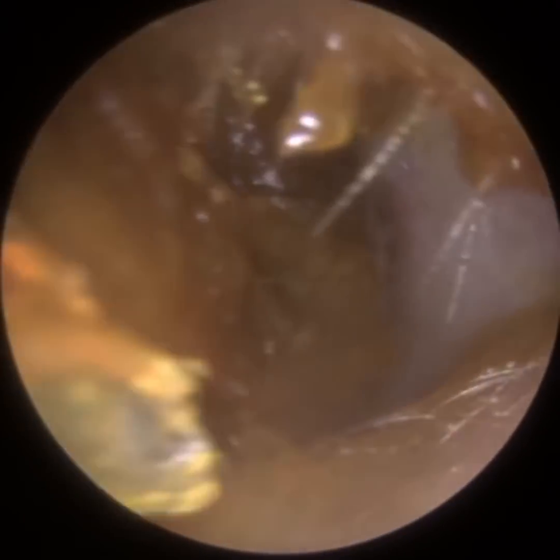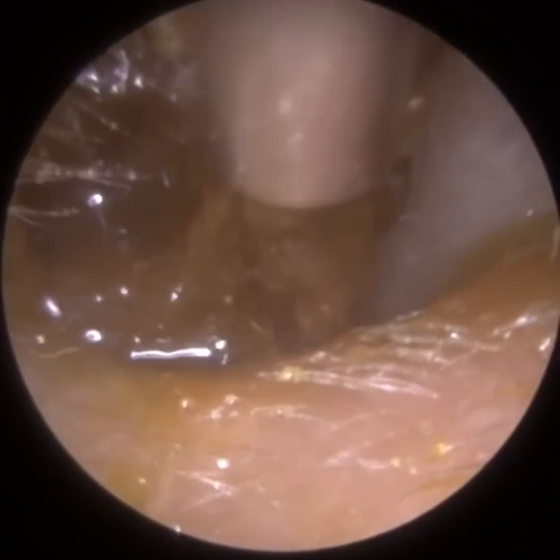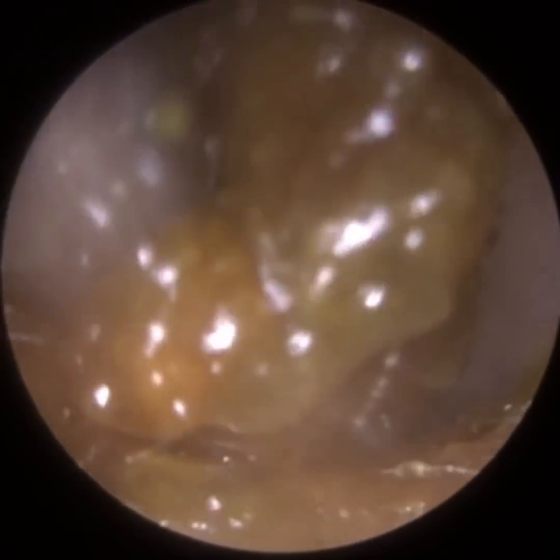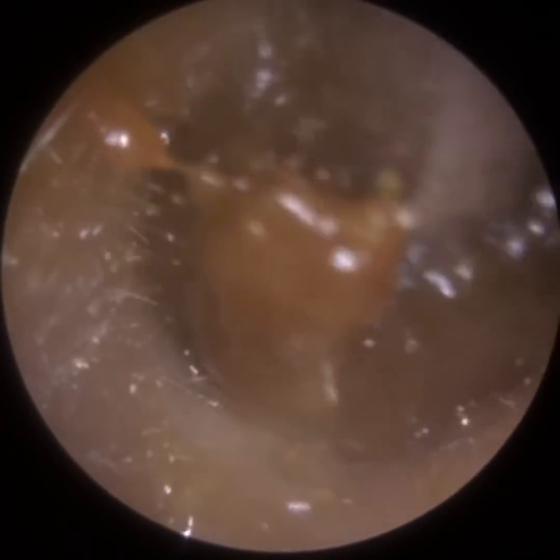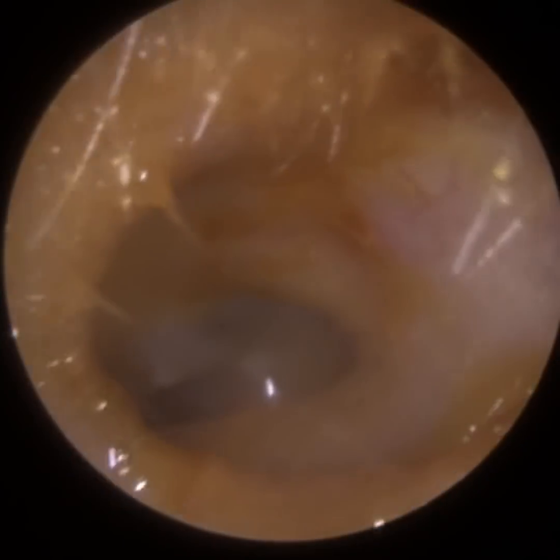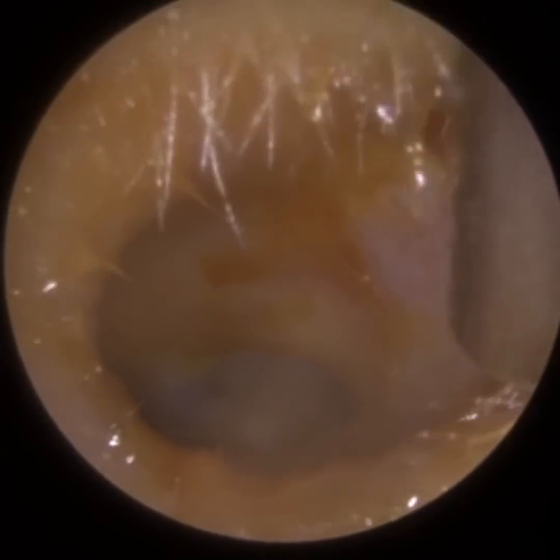So this is the same patient, this is their left ear. I put some drops in straight away, put some more in there. And again, it's very glutinous. So this patient's got the wet wax gene. The wet wax gene means that they've got a modified apocrine gland, which is the same gland found under your armpits.